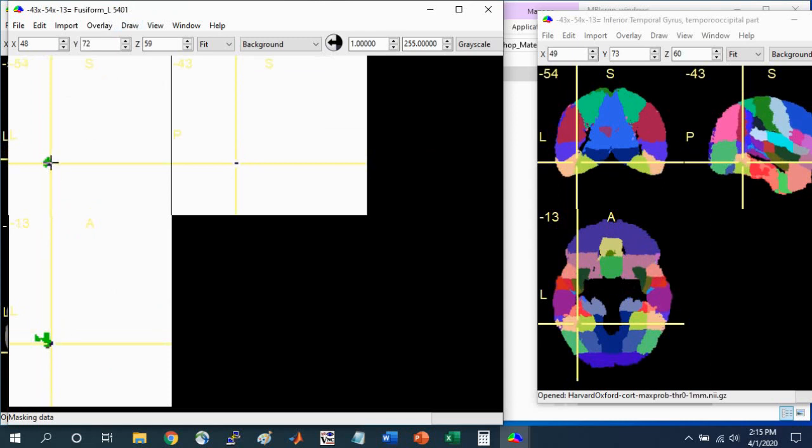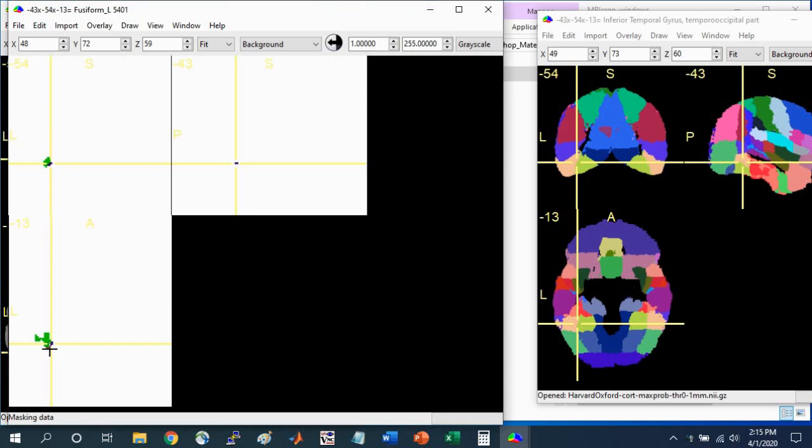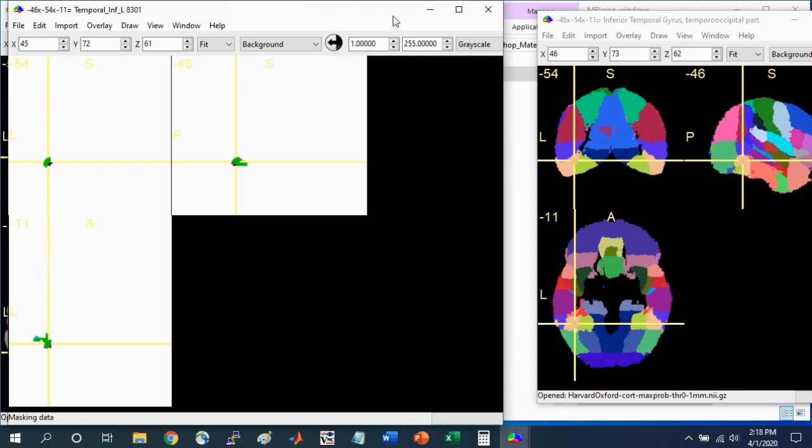Those are the only three regions that we can see. This is just one kind of tricky way to more quickly identify what regions are associated with your cluster. But make sure not to save this underlying file, otherwise you might overwrite the AAL Atlas.